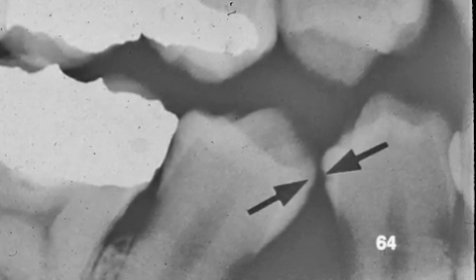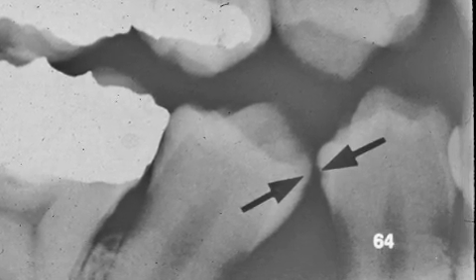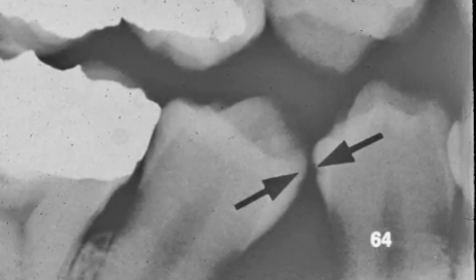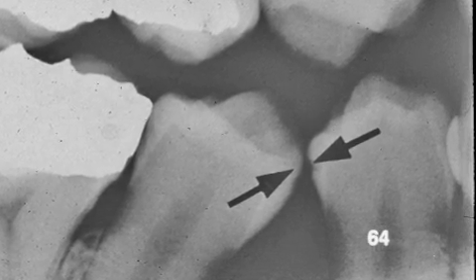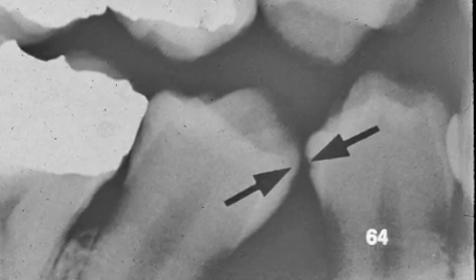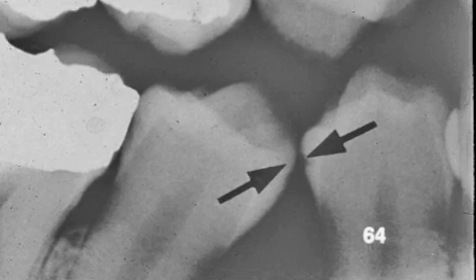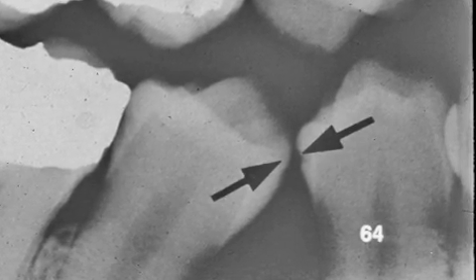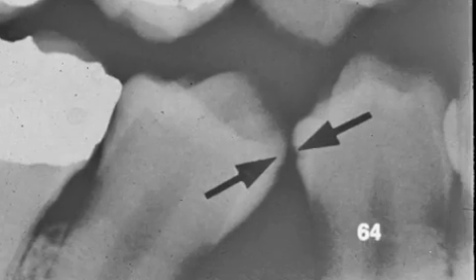Can it remineralize, or will it need a filling? The arrow to your right points to an area where the caries appears to be more than halfway through the enamel. This is no longer incipient — it is C2.